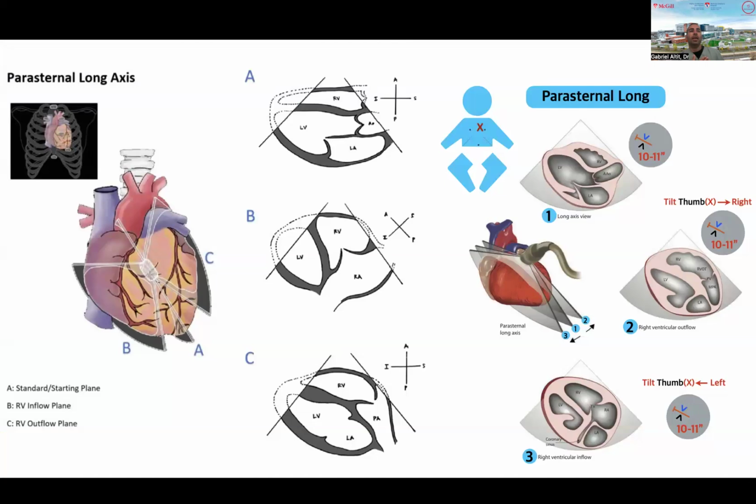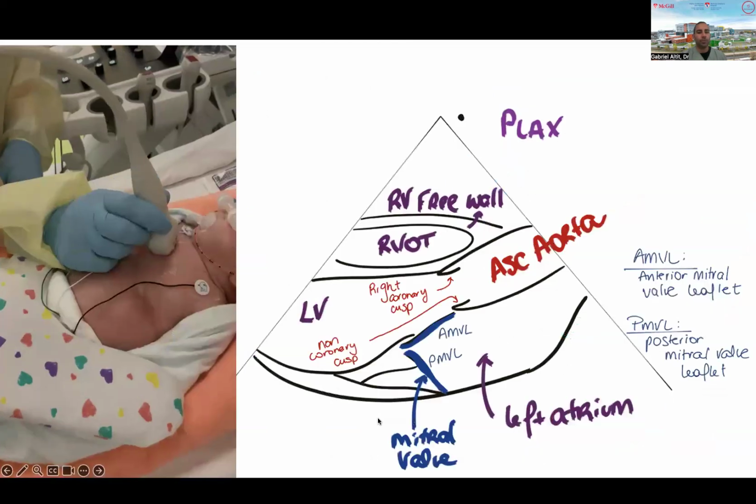So the front is the pulmonary valve and the RV outflow tract and the MPA, versus the back is your RV inlet. And this is the anterior view. So you're more anteriorly positioned, and at this point, you see more of your RV outflow tract, your pulmonary valve, and your main pulmonary artery.